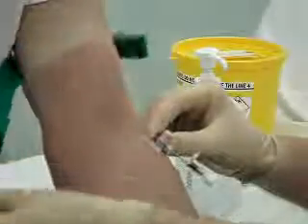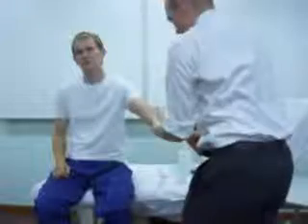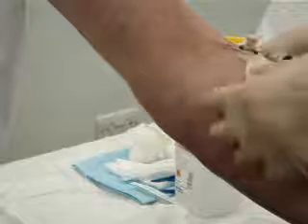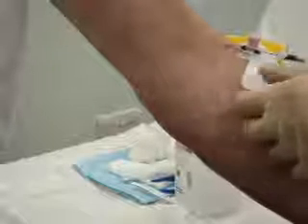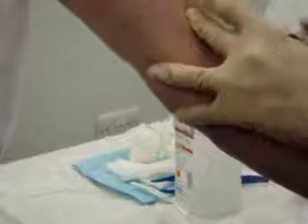At this point, you can take the tourniquet off. So what I'm going to ask Ben to do is just lift his arm up now for the sake of gravity and just for demonstrating. I'm just going to now remove the cap from the end of this cannula. Okay, pop that just to one side for a second. Sometimes it's helpful to put a small bit of gauze down just to help prevent any blowback of blood in this area. But the next trick is to actually pop the cap back on the end of the cannula after you've taken the sharp out.